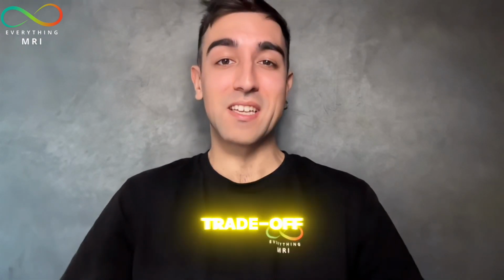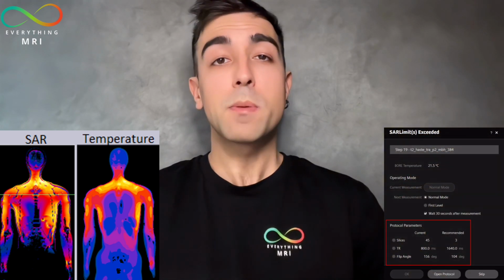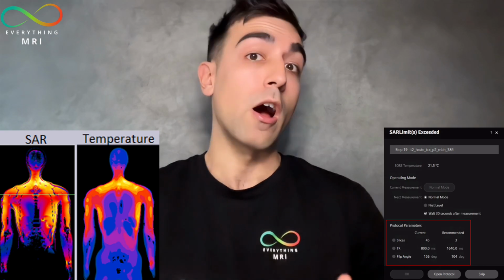But for those of you that are a little bit more seasoned MR radiographers, you know it: MRI always involves a trade-off. Every benefit has potential drawbacks, and TSE, trust me, is no exception. The first major disadvantage we can touch on is linked to the specific absorption rate, the SAR. The repeated 180 refocusing pulses in rapid succession increase the energy deposition, and this isn't just a safety concern for patients, but it can also create SAR conflicts for radiographers, especially when working at 3 Tesla or higher.